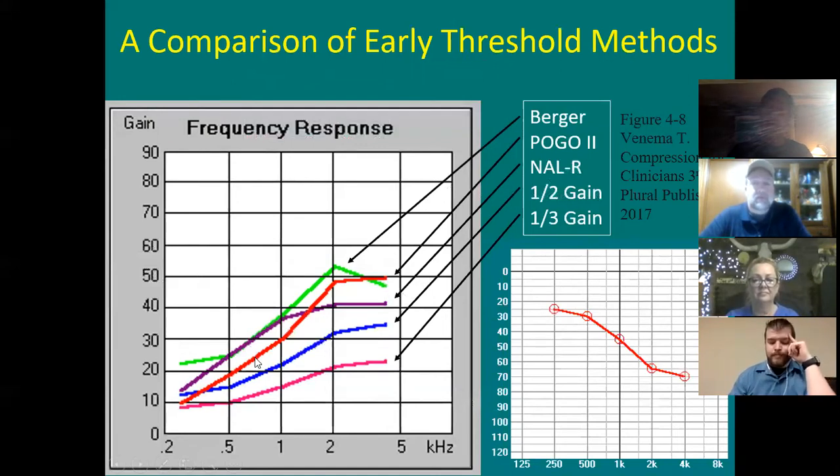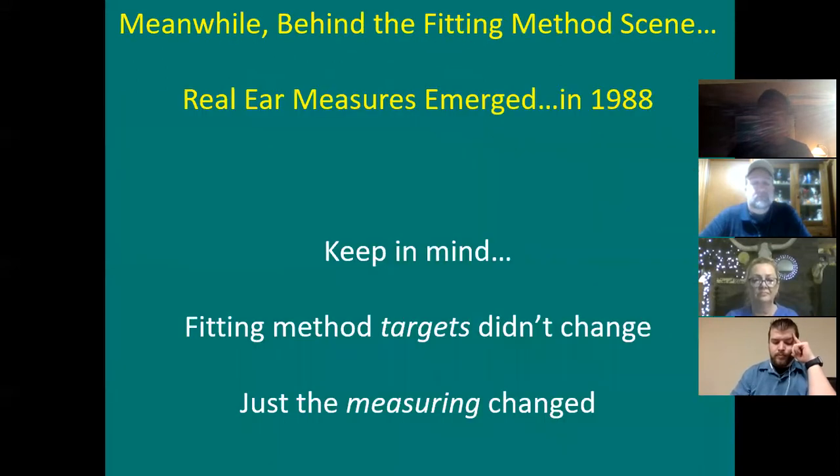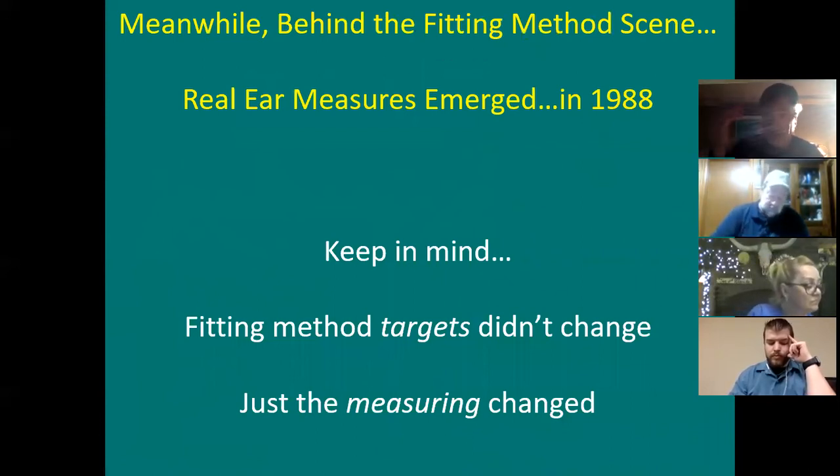So that's really how NAL-R became such a popular fitting method. Meanwhile, behind the fitting method scene, real ear measures emerged in 1988. So while NAL-R had come out and was used a lot, real ear measures emerged. Now keep in mind, the fitting method targets didn't change. Please remember that. The targets didn't change.